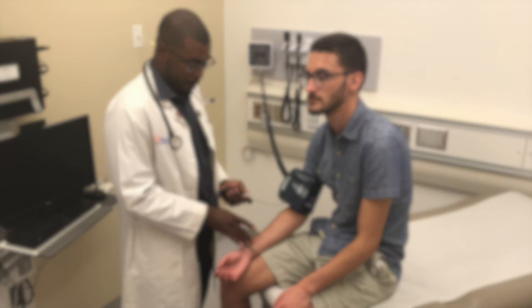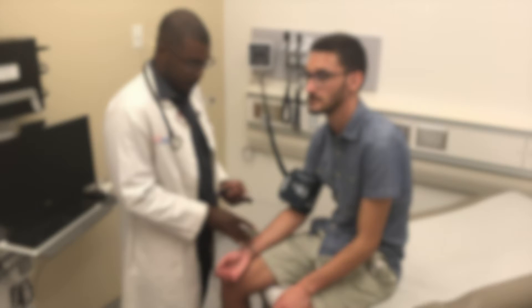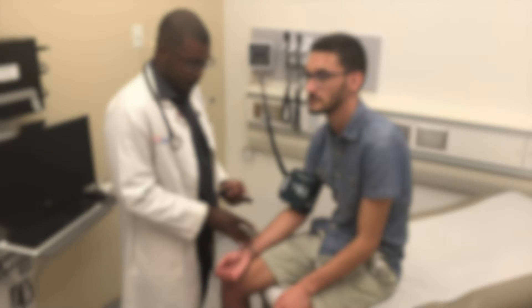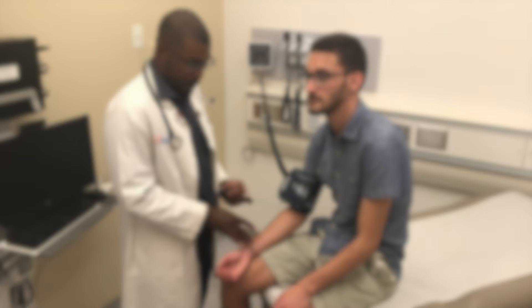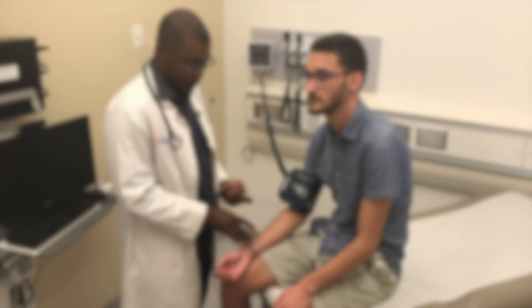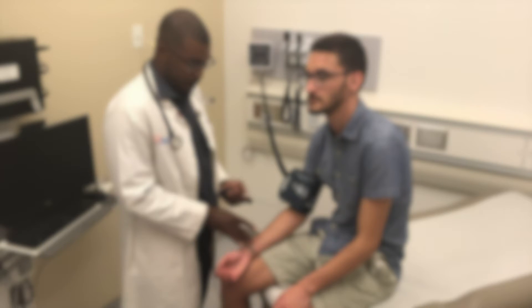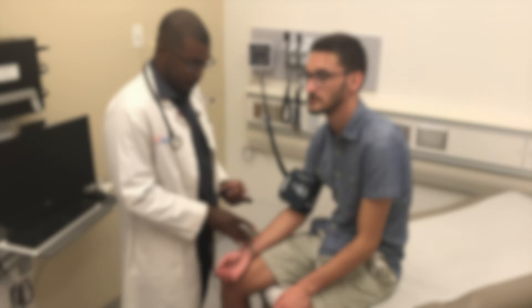The first special test we will discuss is blood pressure measurement by pulse obliteration. We need to pause here to explain when to use this special test and how to do it. You should perform this special test if you either: A, heard Korotkoff sounds immediately at 180 mmHg during your initial blood pressure assessment, or B, if you suspect that the patient may have an auscultatory gap.